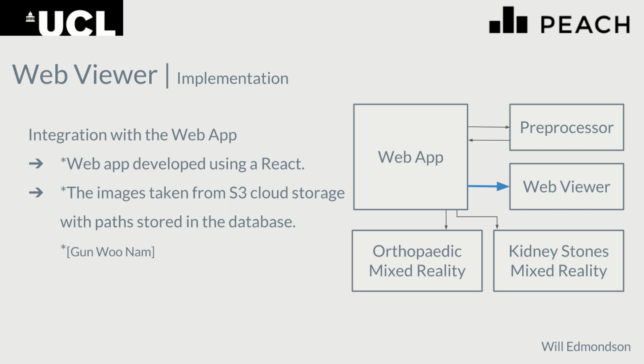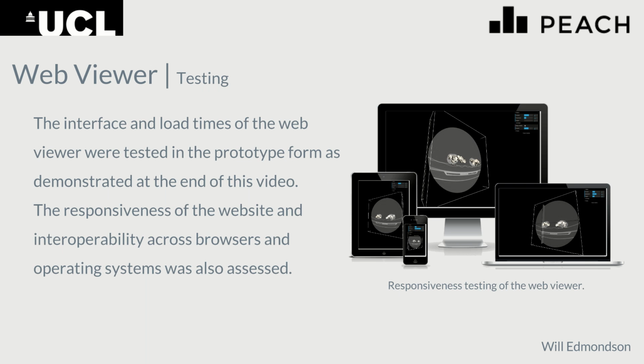Integrating with the web app was mostly undertaken by Gunwu Nam. It's a React web app, and the files are stored in S3 storage. For testing the web viewer, the interface and load times were tested, as well as the responsiveness and the interoperability across operating systems, as shown on the right.